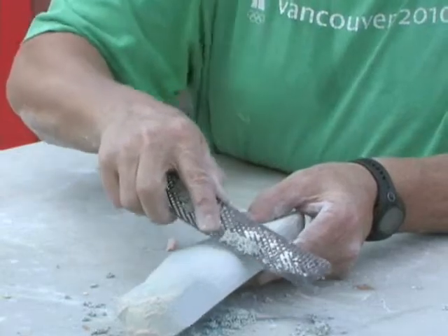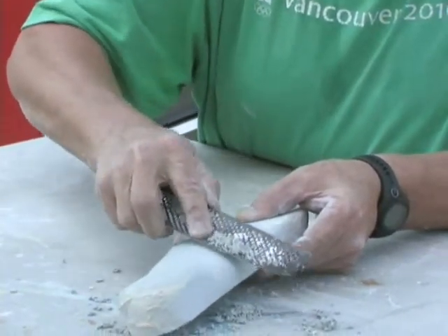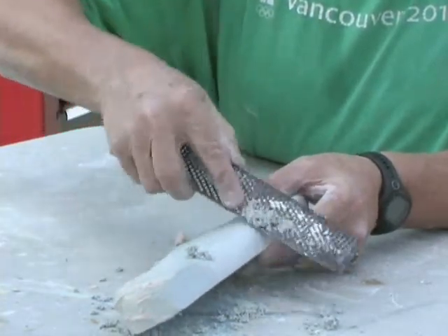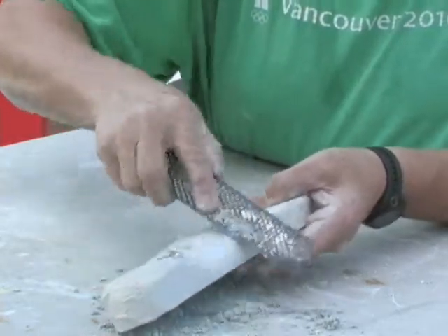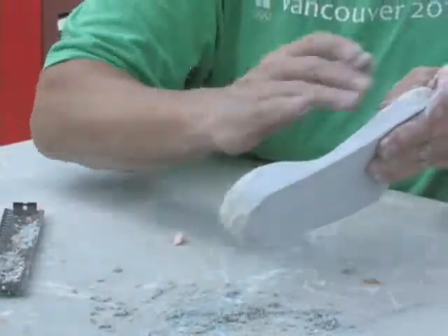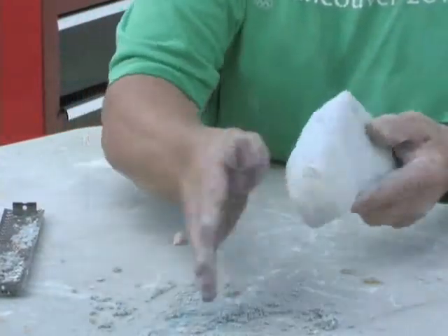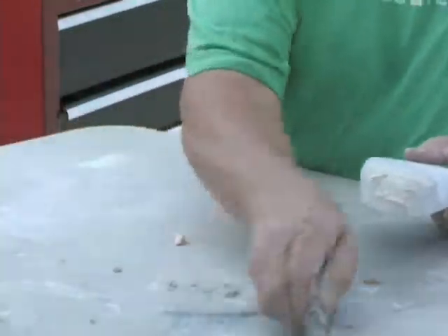I'm using very light pressure, just pulling that file and getting rid of that little ridge — again, not your foot. Now I have the arch, the medial border, the lateral border — everything is good. The heel still needs some attention, but I'll scrape this off.